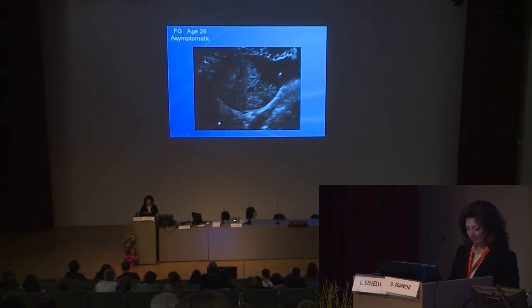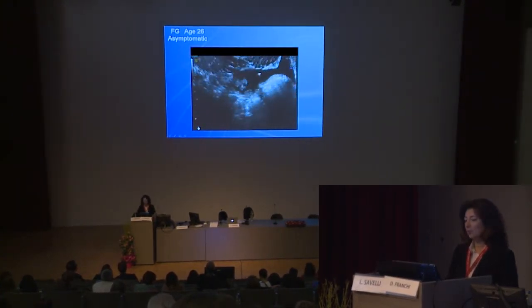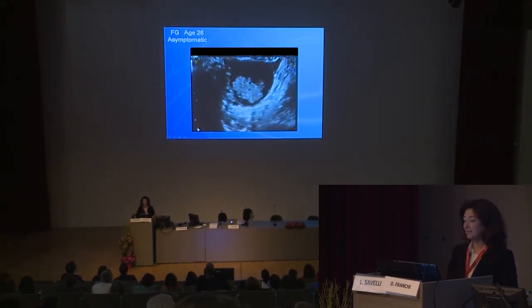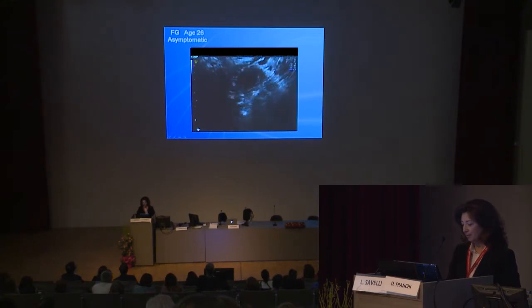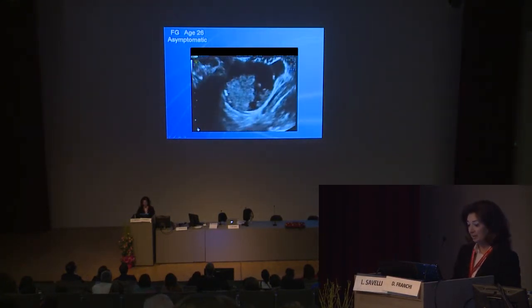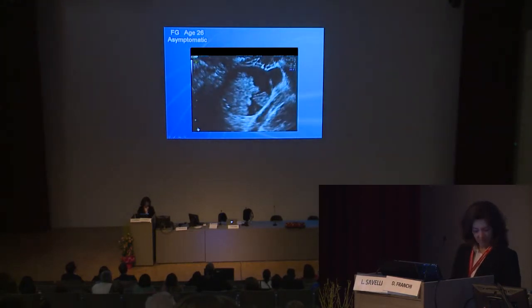Okay, here we are. As I show you the clips, this is a small unilocular solid cyst with a solid portion, papillary projection, multiple papillary projections. Oh my God.